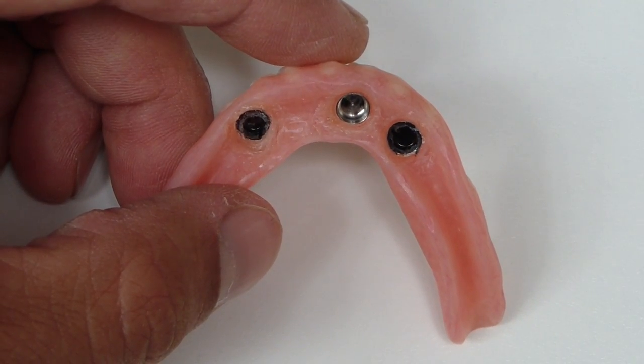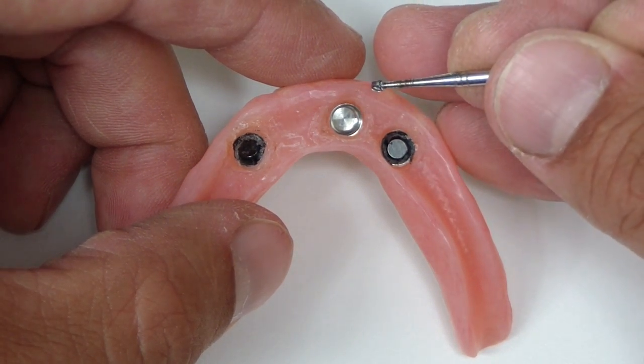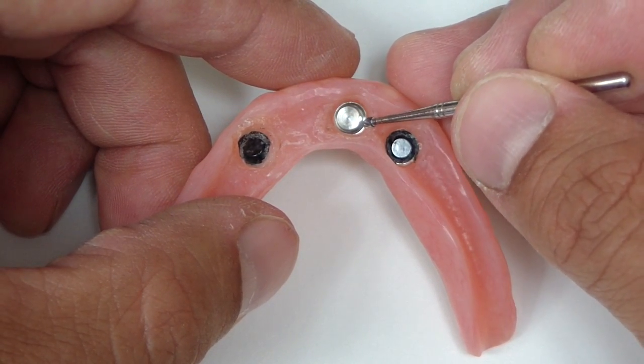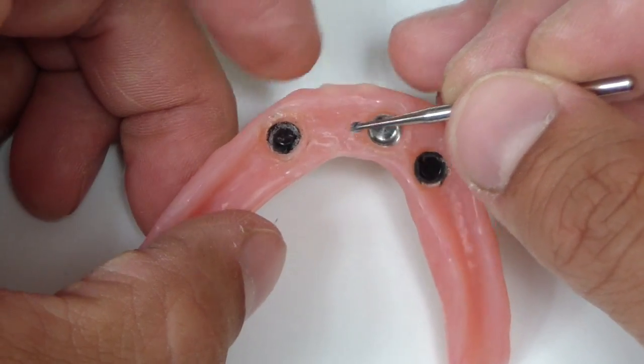One of the tips that Dr. Dre showed, as I was watching him remove the flash, was just using a number six round lab burr. Instead of using one of those large football burrs, just use a round burr to remove the flash from around here.